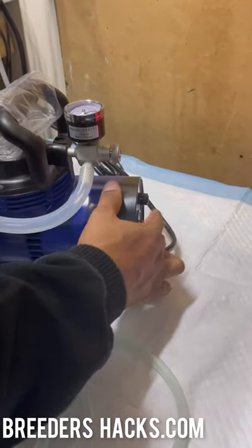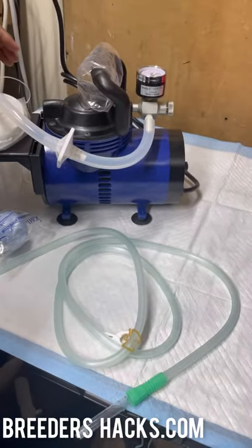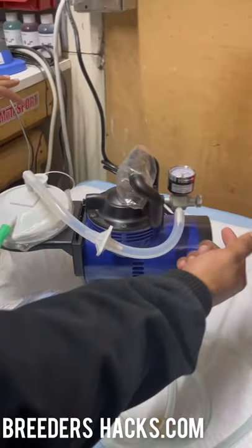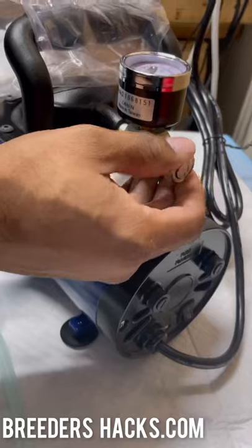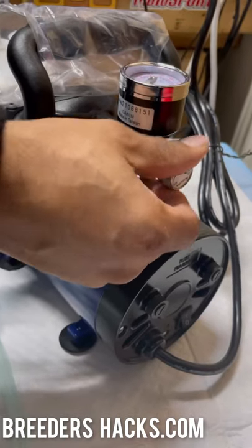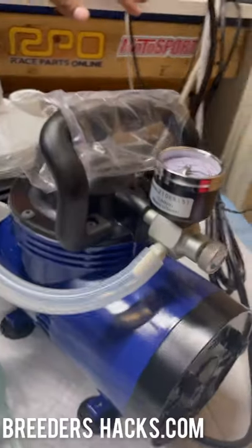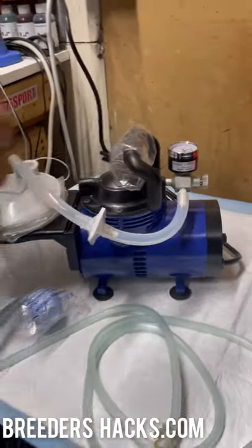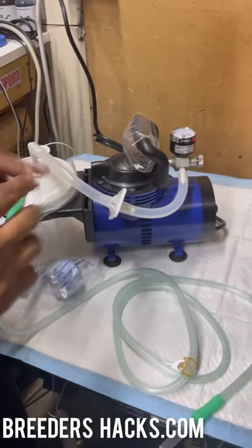Go ahead and plug it in, then hit the switch — and it's ready to go. On the right side you can adjust the pressure higher or lower to set it to your desired level. When you first get it, turn it on and make sure it's running smoothly — it does need to build up a little pressure.